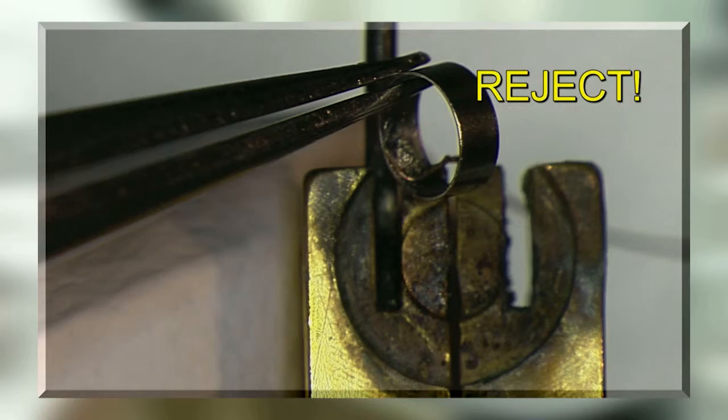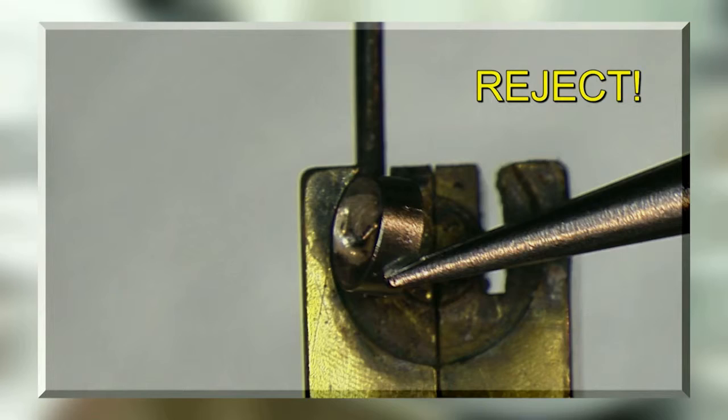If the paste is clumpy, it was underheated. If the braze and or the wire is darkened, then it was overheated.